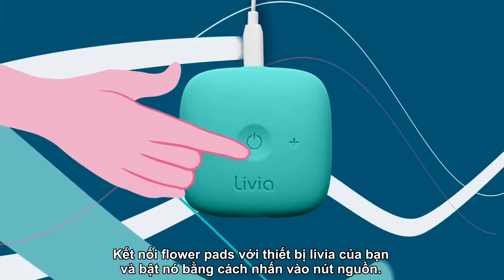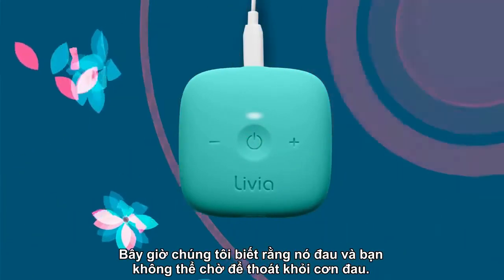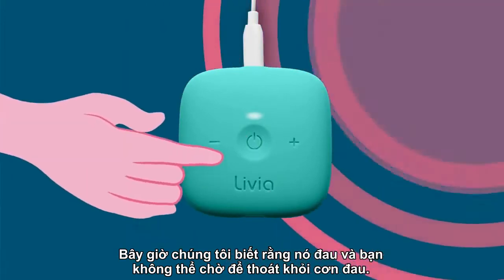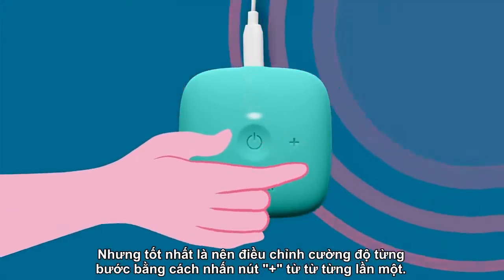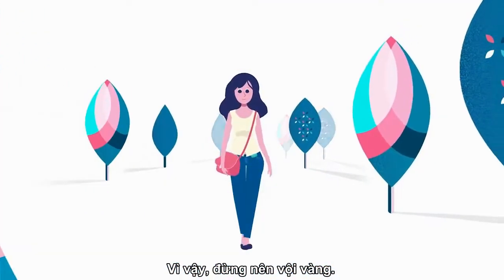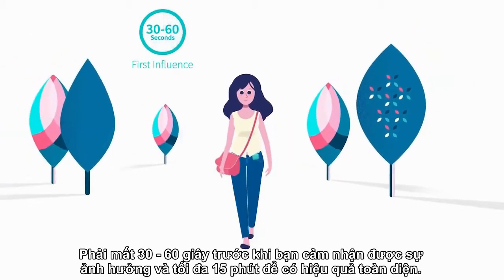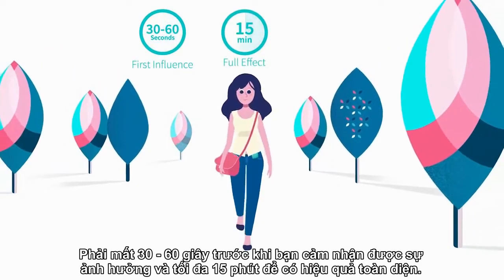Connect the flower pads to your Livia and turn it on by pushing the power button. We know it hurts and you can't wait to get rid of the pain, but it is most recommended to adjust the intensity step by step by pushing the plus button one click at a time, so don't rush in. It takes 30 to 60 seconds before you're going to feel the influence, and up to 15 minutes for the full effect.